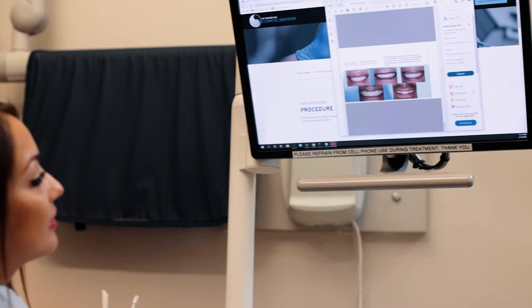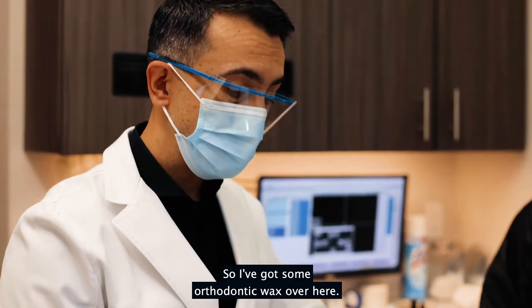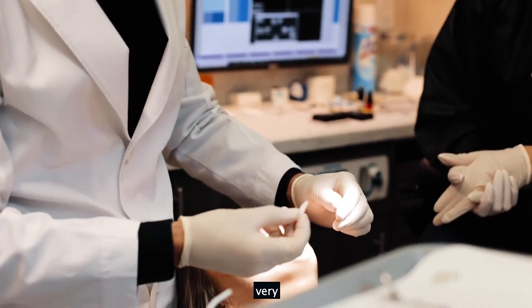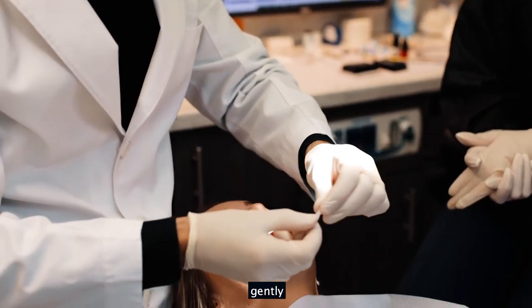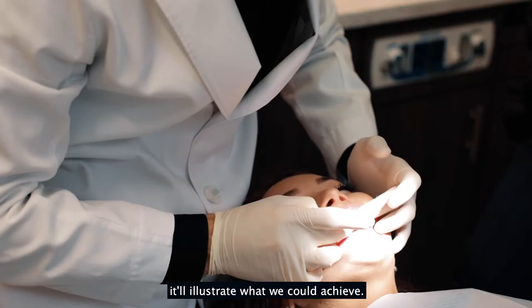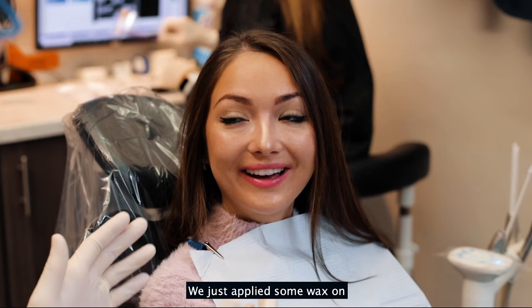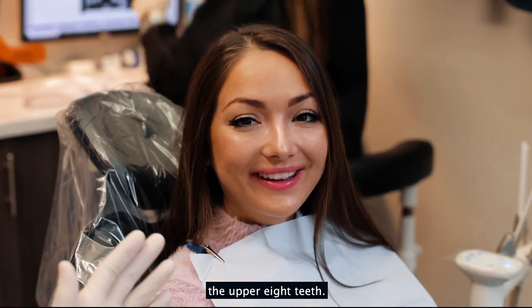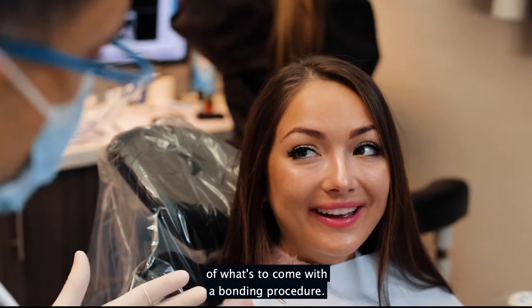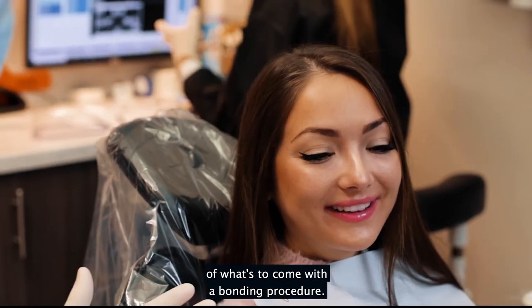Now let's get to work. I've got some orthodontic wax here — it's very simple to just apply onto the teeth very gently and it'll illustrate what we could achieve. We just applied some wax on the upper eight teeth in order to illustrate the new smile that's to come with the bonding procedure.